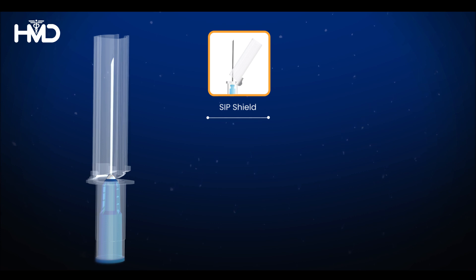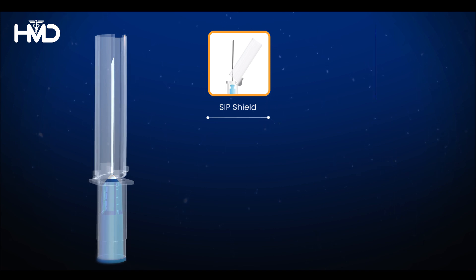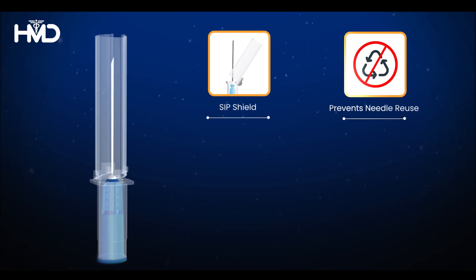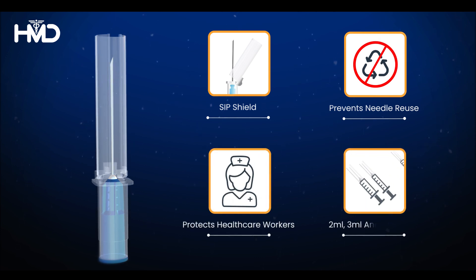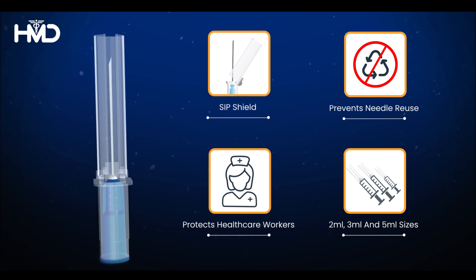Disbeject safety syringe offers a range of benefits: the soft closure of the SIP shield avoids any aerosol or contamination that can be generated through blood spatter, prevents needle reuse, and protects healthcare workers. Available in two milliliters, three milliliters, and five milliliters sizes to cater to diverse needs.